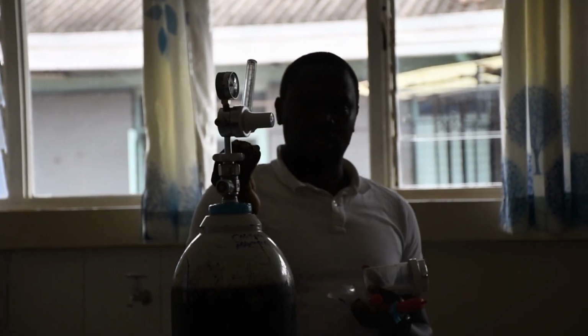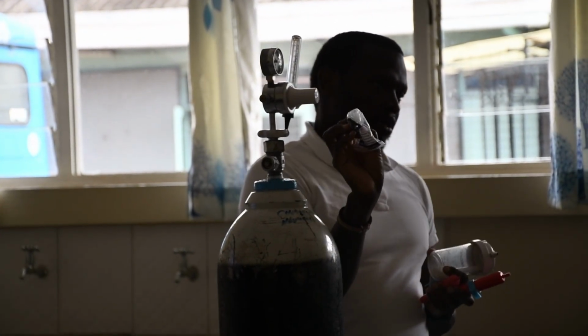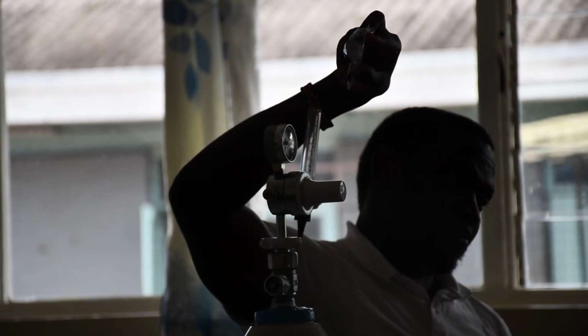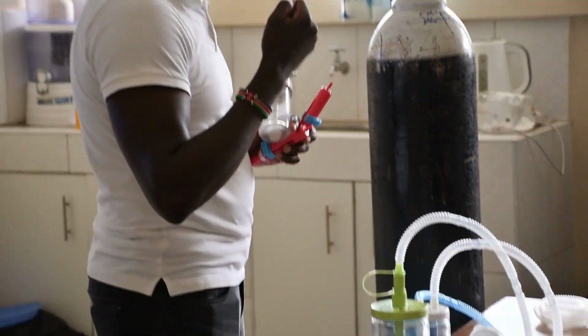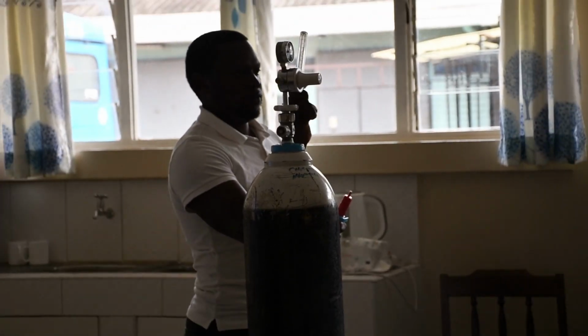For this system, for example, the green one fits. If the green one doesn't fit, then you try the other one. Just remember that the other one comes with a rubber ring to prevent any leakages from that particular point. The green one doesn't require a rubber ring most of the time because it fits on well. So that is what is going to fit to your source.